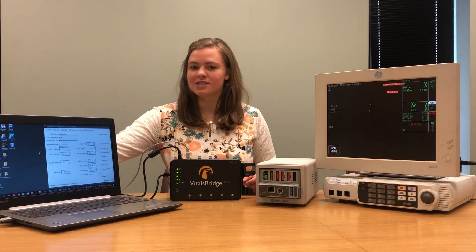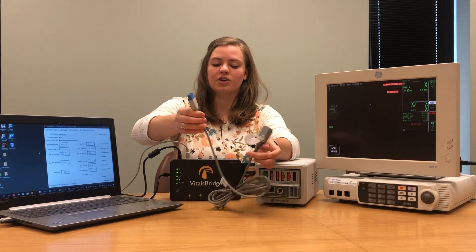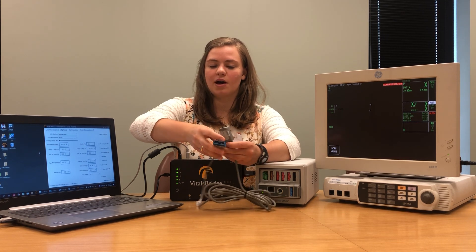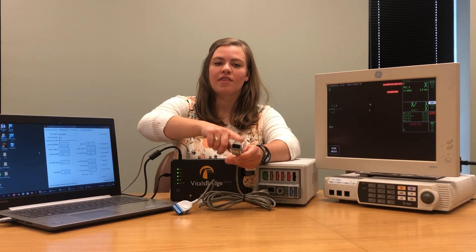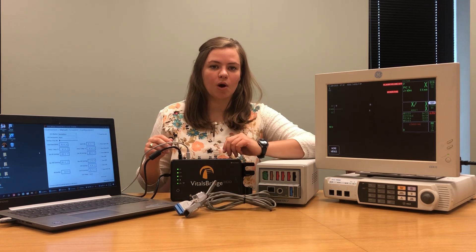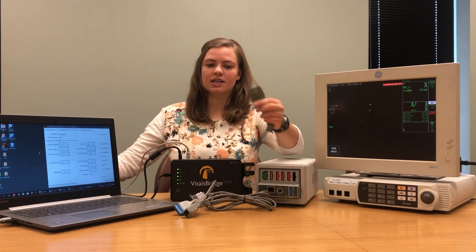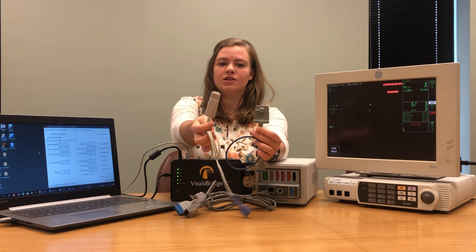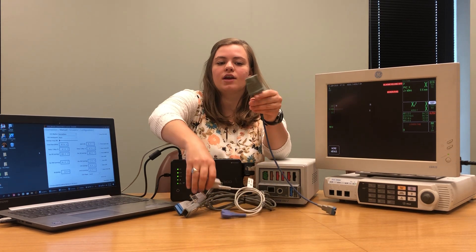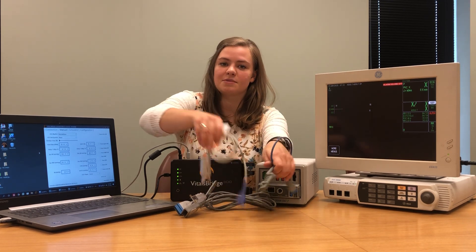The first vital sign we're going to connect is SPO2. The cable that connects to your patient monitor should look like this. You have one end that plugs into your patient monitor and another end that's going to plug into an SPO2 probe. You're welcome to use any reusable probe with your VitalsBridge. Most SPO2 probes look like one of these two options — one that's a clip and one that's a rubber sleeve. We're going to be using the rubber sleeve today for our demonstration.